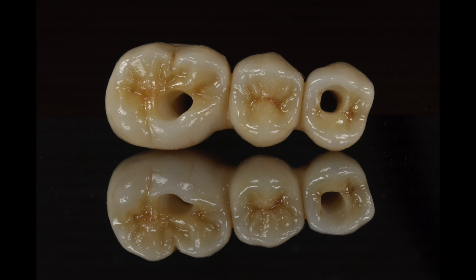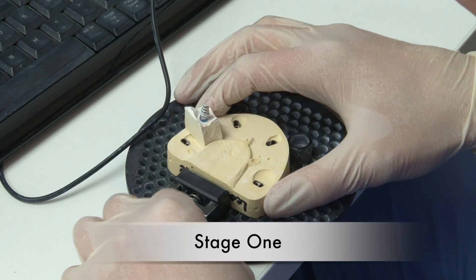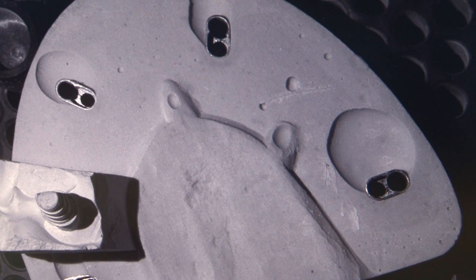So, how is it made? To begin, the scanning model with a prepared tooth or implant is put into a three-dimensional scanner using red light, laser or blue light technology and scanner software.